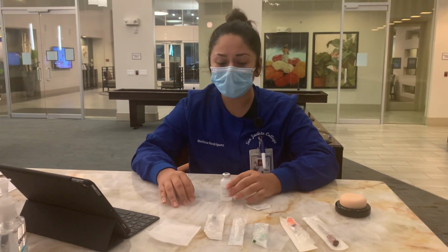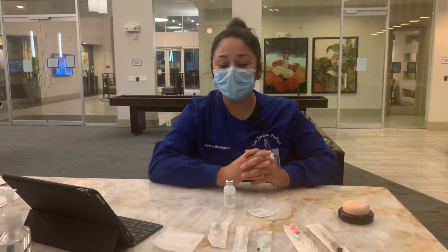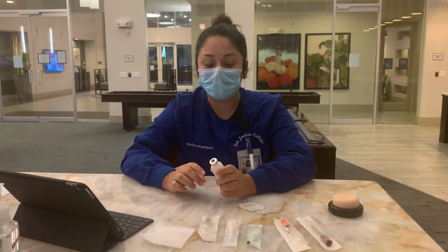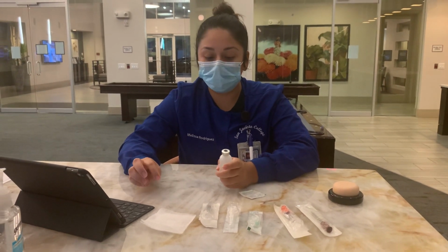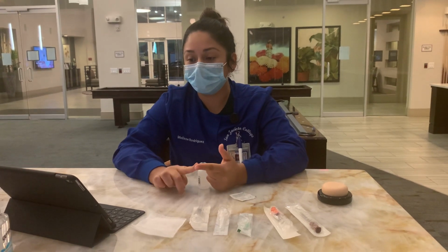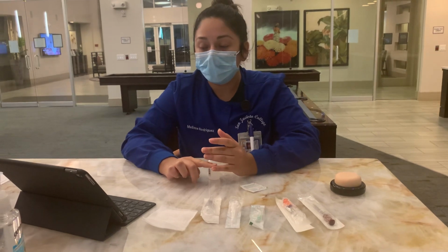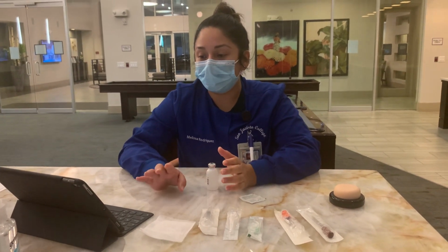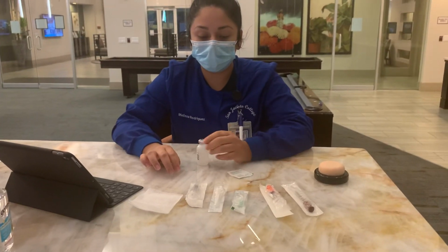No. Okay, so I'm gonna go ahead and wash my hands, put my gloves on. I'm also gonna verify my medication one more time on the monitor and the expiration date. I'm gonna make sure I have the right patient, right drug, right dosage, right route, and right time. Once I have all that, I am going to start preparing my medication.